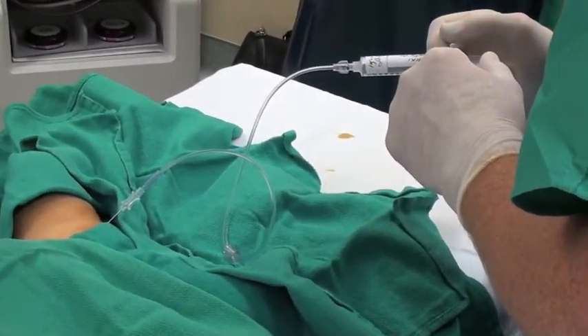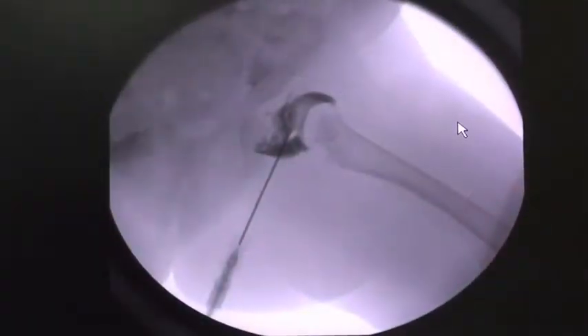Just a small amount of dye. And that's what it looks like on the x-ray with the dye in the joint.